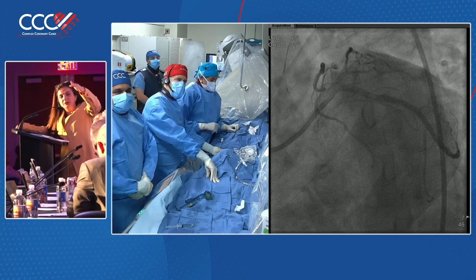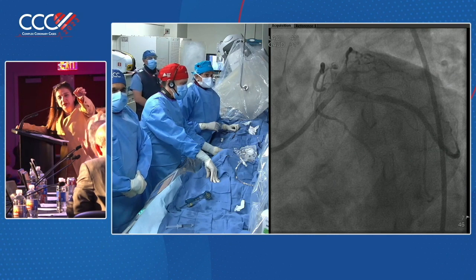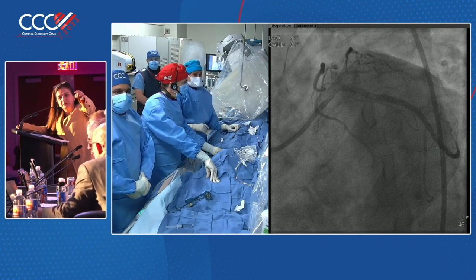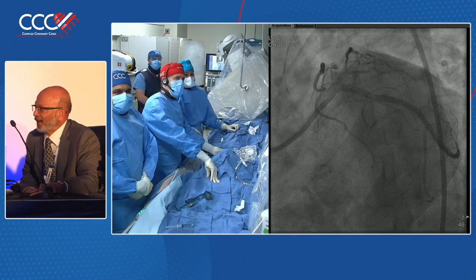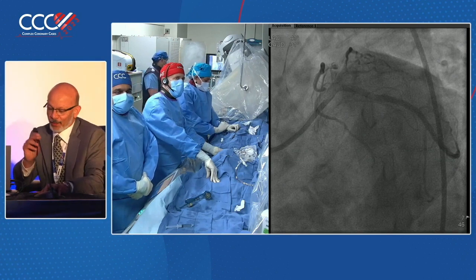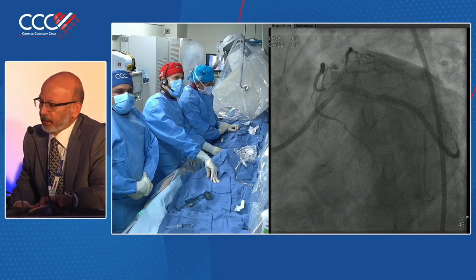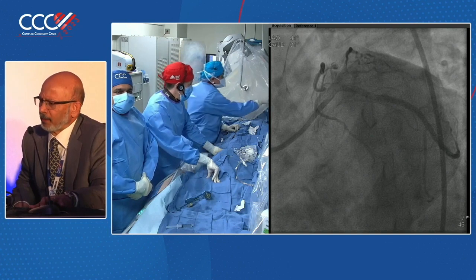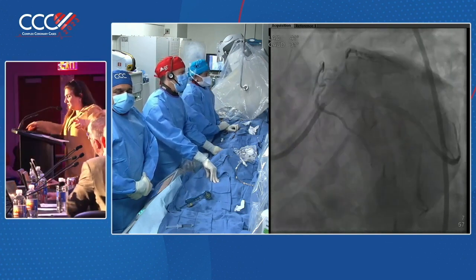Anyone on here would be staying with Antonio? He wants to nail the ostium. You want to nail the ostium? He's going to nail the osteo. I think the imaging will tell us the size, and if there's much calcium, then maybe do IVL and then do it, but probably you don't need it. And I think Nitin stands by you. So you got 3 people.